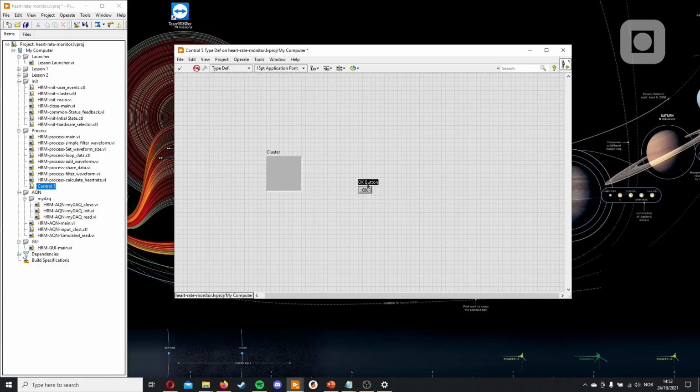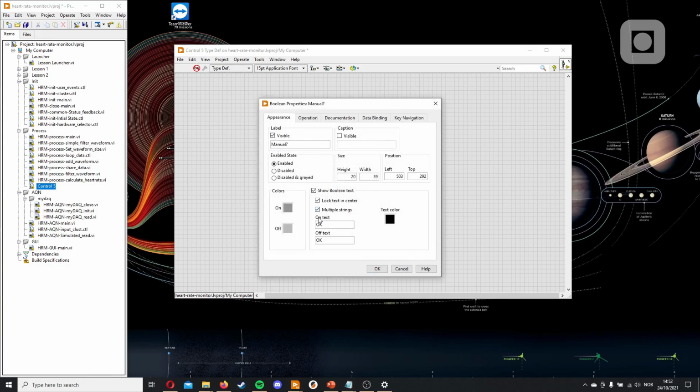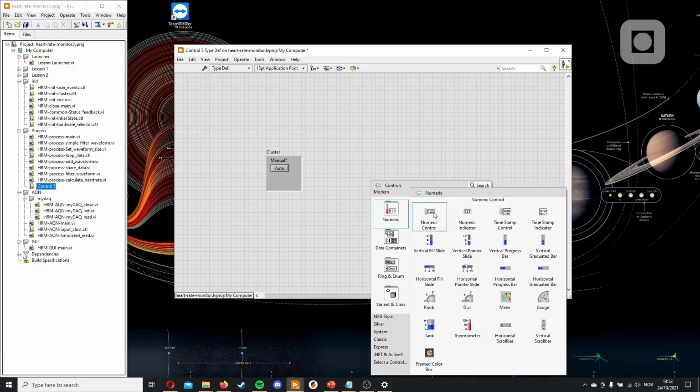which turns it on or off, so we can have manual or auto. And then here we'll just add multiple text. When it's off, it's auto, and then when it's on, it's manual. And then we need to define what our top levels are.